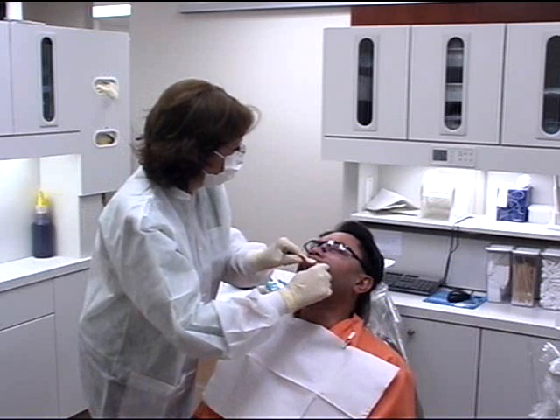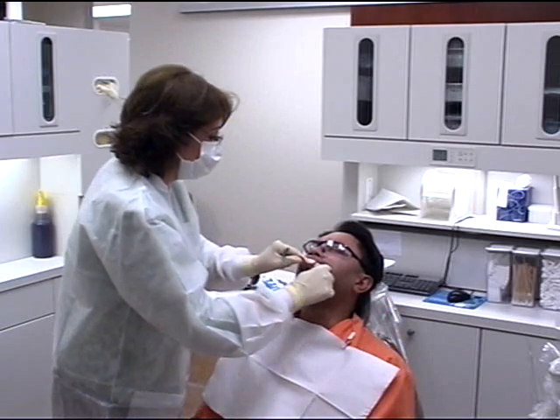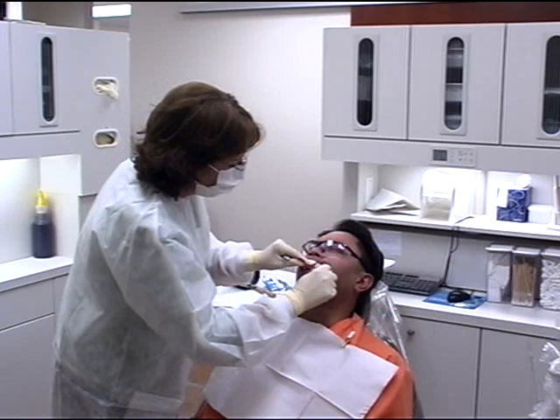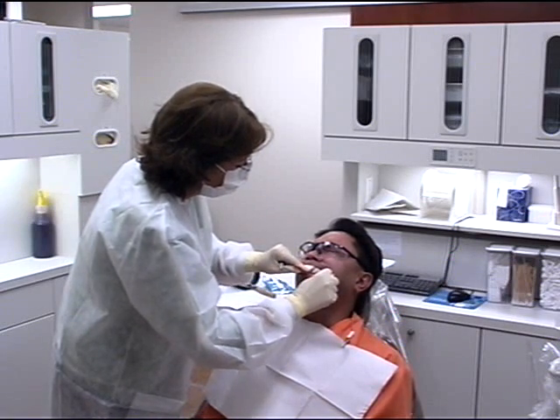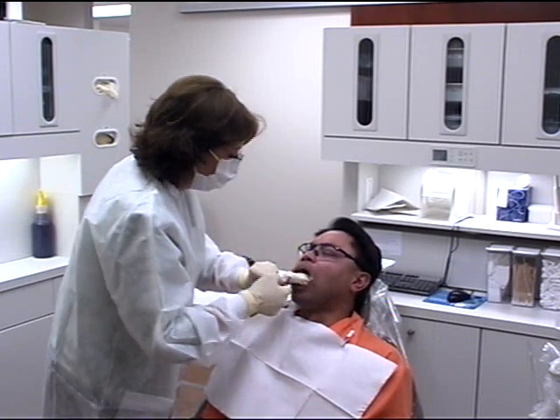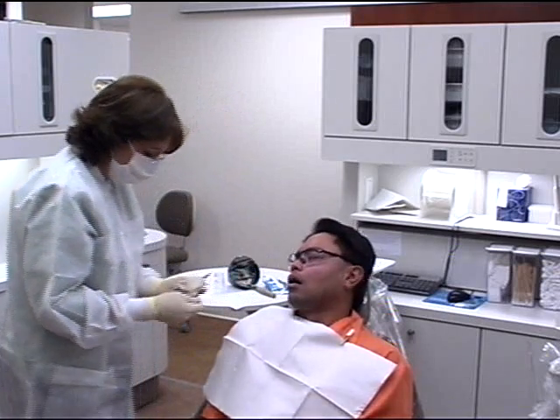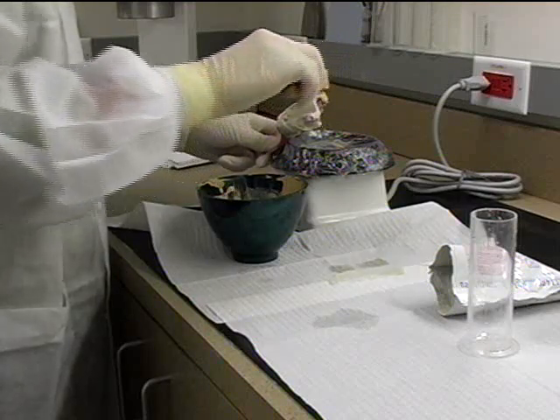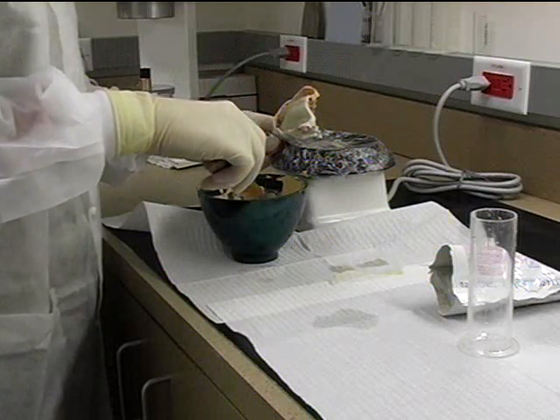Alginate impressions are used to register and reproduce the form of the teeth and oral tissues and the relationship with each other. The impression gives a negative reproduction of the oral tissues. A positive reproduction of the tissues, a model, is then made by pouring dental stone in the impression and allowing it to harden.